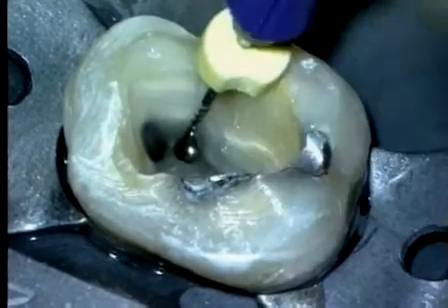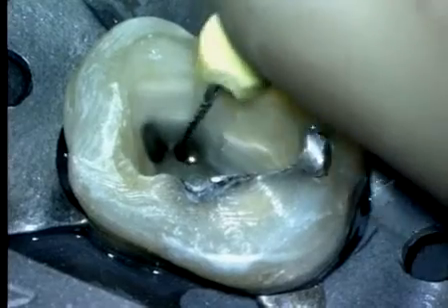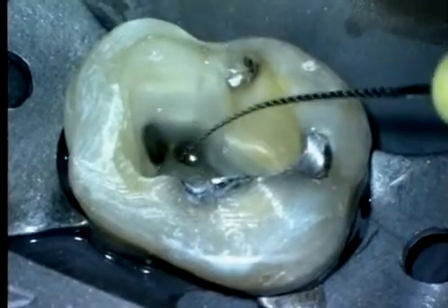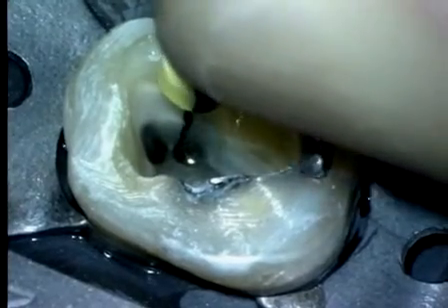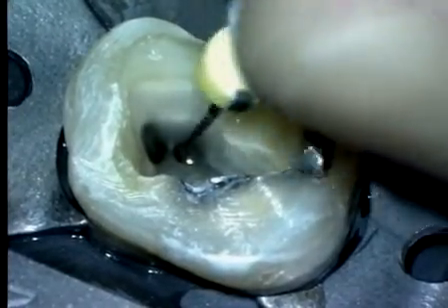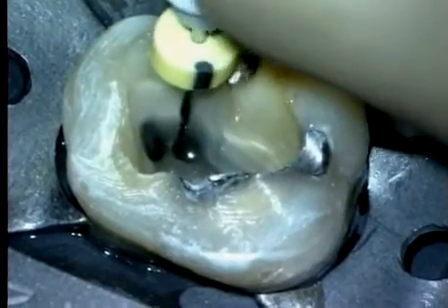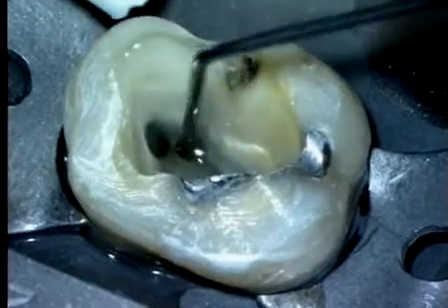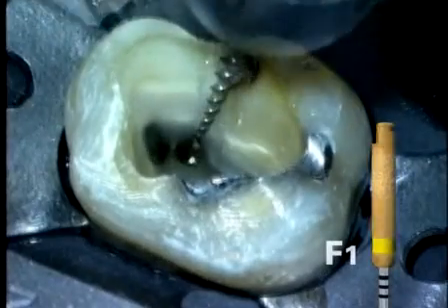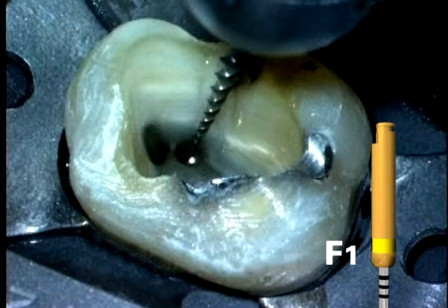The 10 hand file stirs the solution and moves debris into suspension where it can be subsequently liberated from the root canal space. The 15 file follows the 10 and assures us that rotary can follow. It's important to confirm working length at this time because, again, remember that a shorter, more direct path to the terminus exists. Finisher number 1 is the instrument of choice and follows the use of Shaper 2.